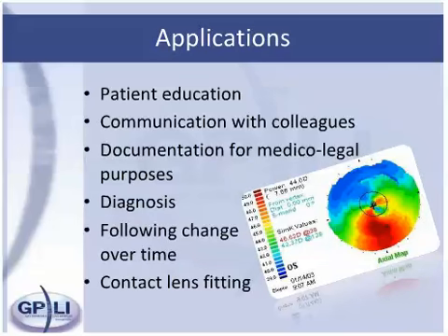Clinical applications for corneal topography include patient education, communication with colleagues, documentation for medical legal purposes, diagnosis, following change over time, and contact lens fitting.